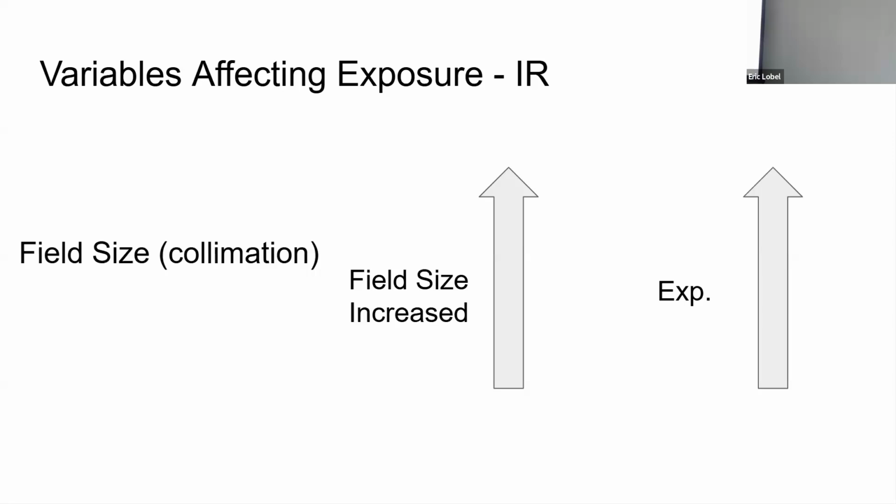So it's good for contrast because it cuts down scatter. That's kind of like what happens first. Scatter is cut, and thus contrast goes up. Why is the scatter cut? It's about where the scatter is. Remember, there's more scatter divergent.